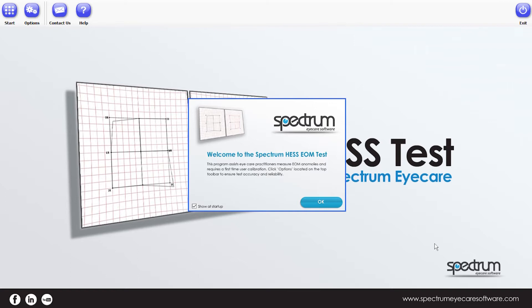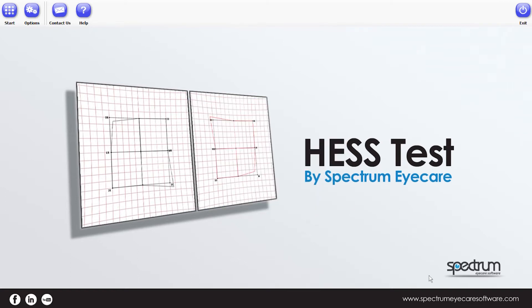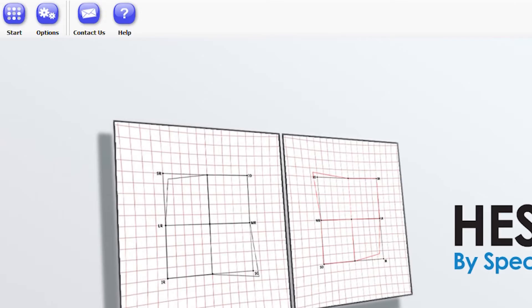This will open the HES intro screen. By the way, this is the screen you'll see if you download the test directly. If you select Help from this screen, it'll give you the practitioner guidelines of how to conduct the test. By default, the patient is positioned 50 centimetres from the computer screen.